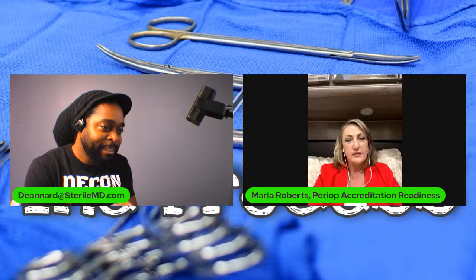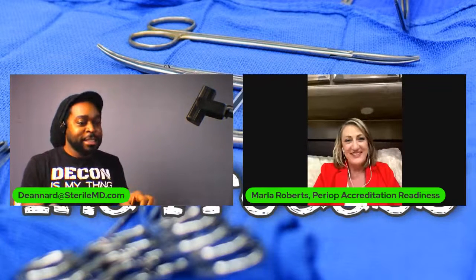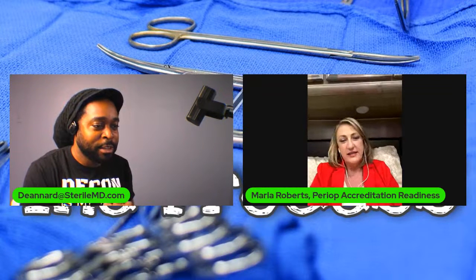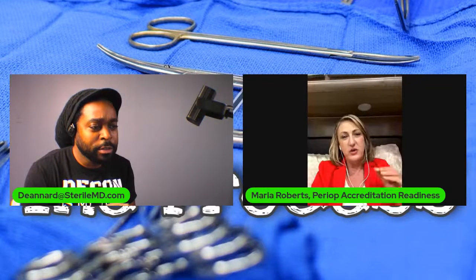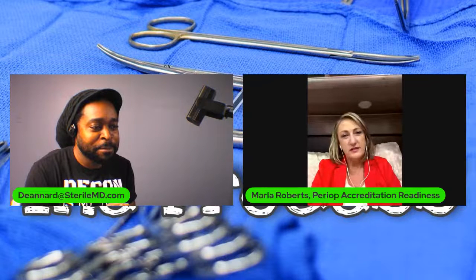No. Correct. If your scissors are closed, how did you contaminate them on the inside? No, for sterilization in a peel pack. Did that change? I think I heard that change. I have to go and refresh my knowledge. If it did, please let me know, because no. If you have a set of Mayo or Metz scissors and you close them, how are you sterilizing the inside of those where they're actually doing the cutting? You're not. Okay.